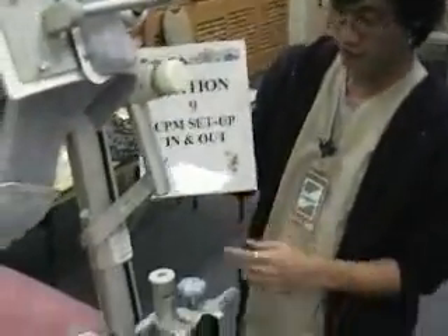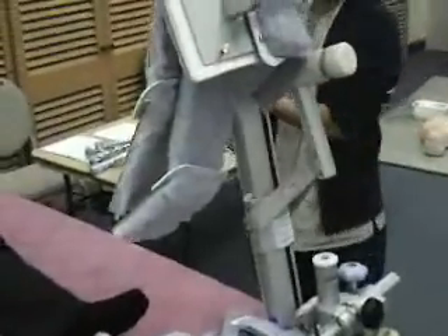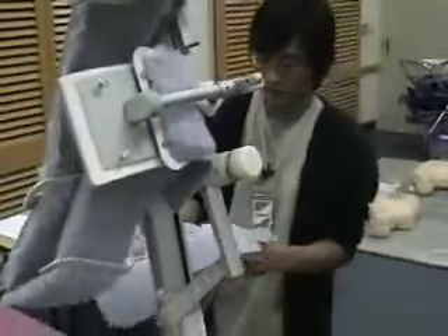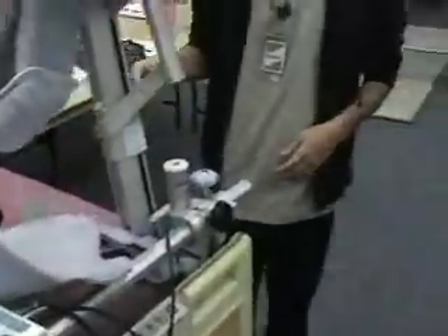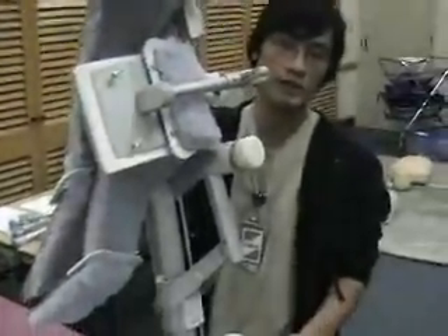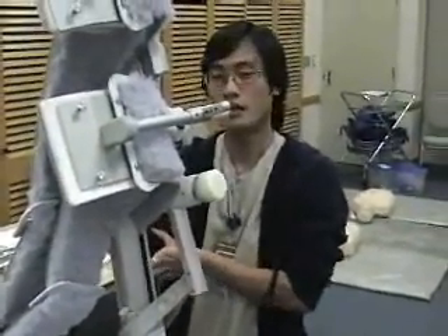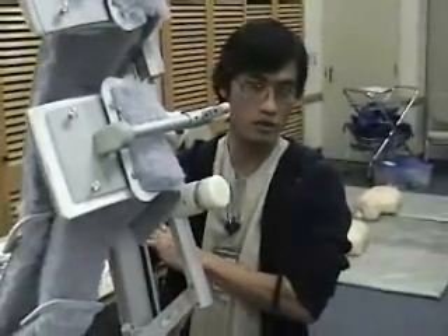What we're going to demonstrate today is CPM setup, in and out, with the patient. This is basically what we use for post-op day one for total hip or total knee arthroplasty. Sometimes we also use it for post-op day one arthroscopic knee surgeries. It depends on what the doctor orders.